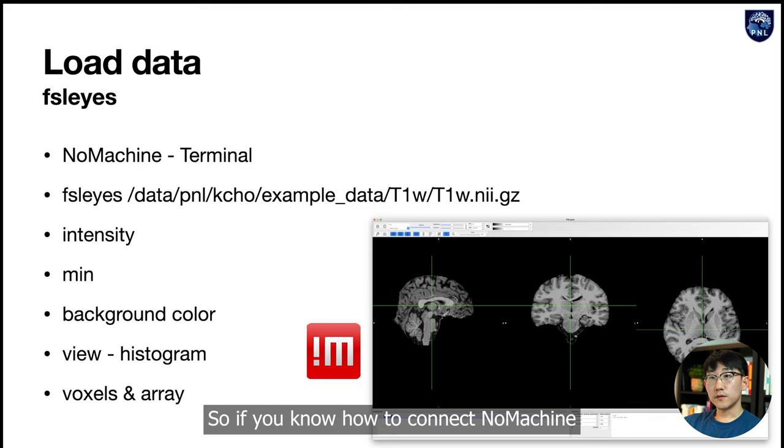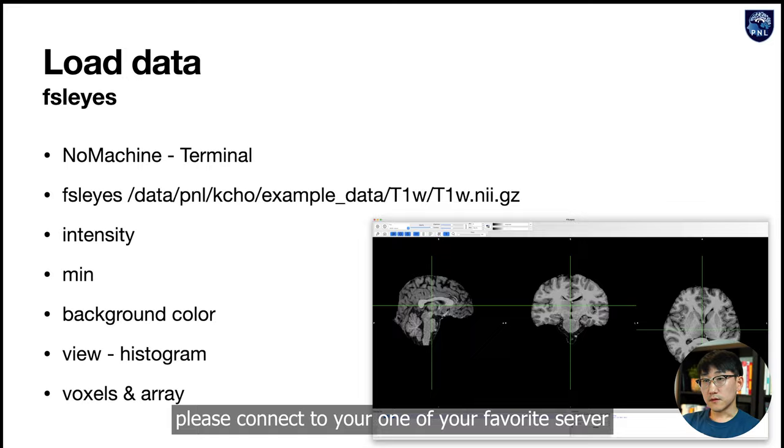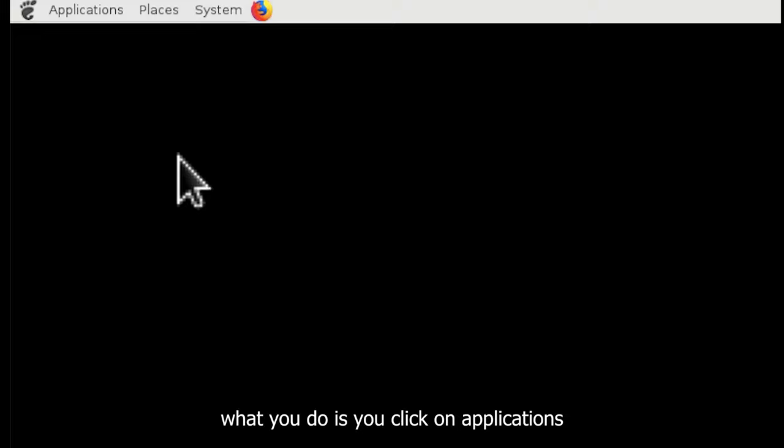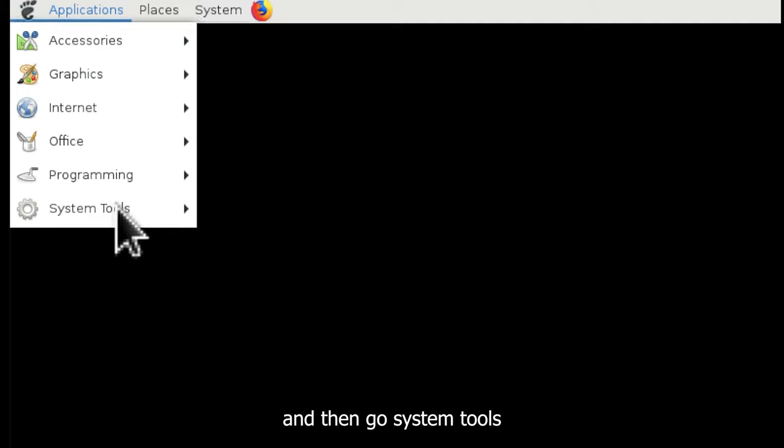If you know how to connect to NoMachine, please connect to one of your favorite servers. This is my NoMachine. What you do is click on Applications, then go to System Tools, and click on Terminal.